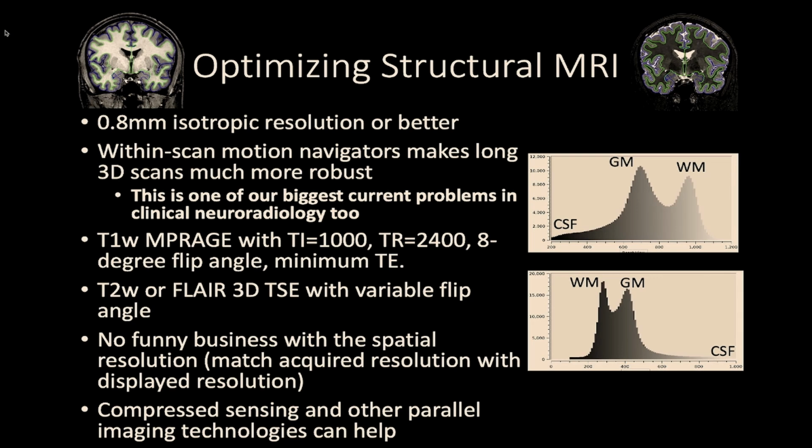Compressed sensing and other parallel imaging techniques can be very helpful when used in moderation.